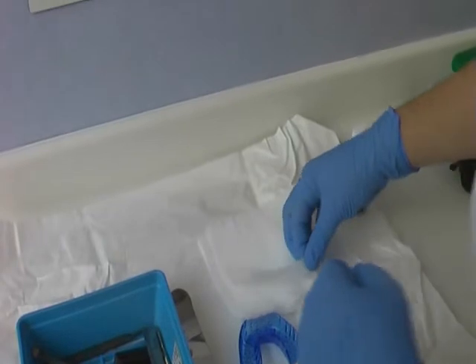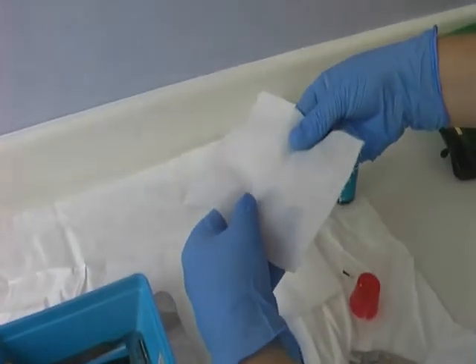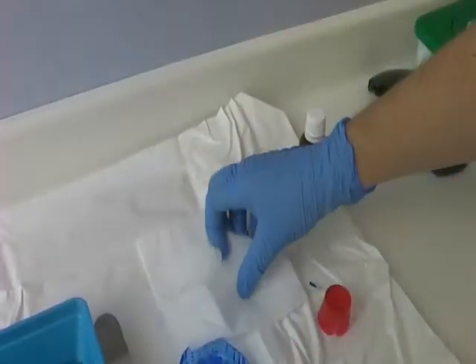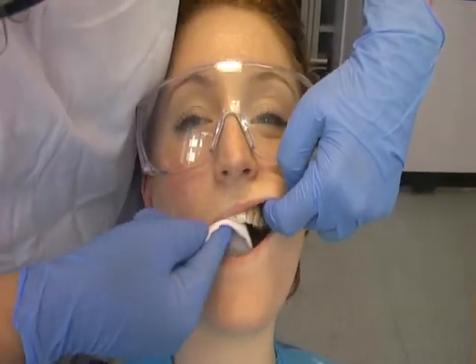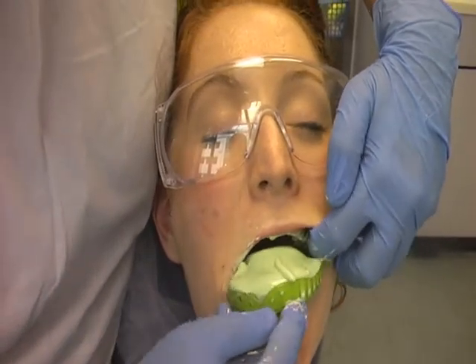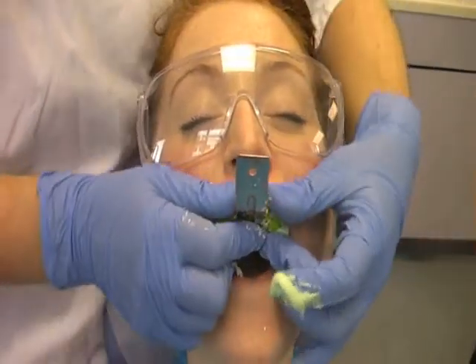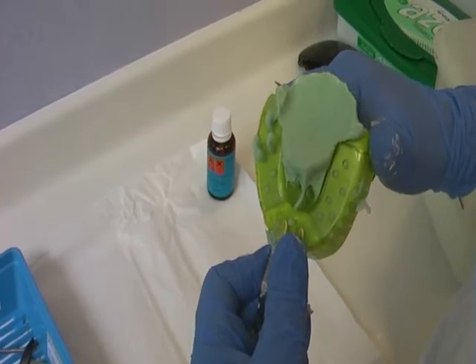In clinical instances where excellent detail of the dentition is needed and where a sulcus impression is not important — for example splint construction, wax up, or face bow — the following technique can prove useful. Roll two pieces of gauze and get the patient to bite down on their posterior teeth. Using another piece of gauze, wipe dry the dentition prior to applying the alginate directly to the occlusal surfaces. Insert a fully loaded alginate impression tray. Using a scalpel remove any unsupported alginate, then disinfect your impression as shown previously and it is ready to be sent to the lab.